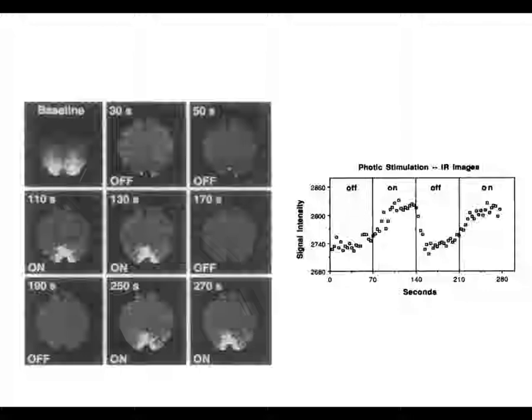And the logic there was that brain areas that are sensitive to visual stimulation should show changes in this BOLD signal that correlate with that, right? So when the stimulation's on, activity should go up. When the stimulation's off, activity should go down. And brain areas that aren't doing visual processing shouldn't show that systematic fluctuation. Whatever they're doing, whatever noise is in there, it shouldn't be systematically correlated with the stimulus presentation.